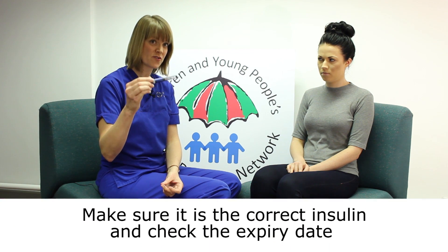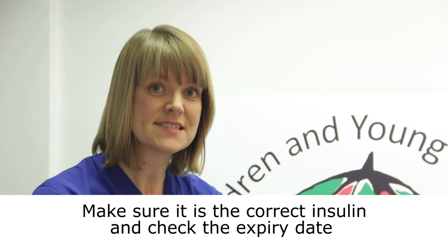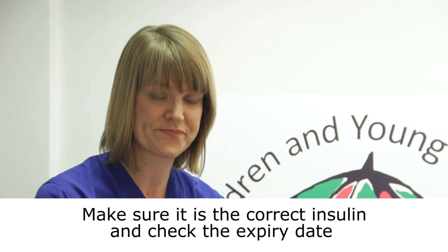It's important that you check that the insulin you're about to give is the correct insulin for the time of day, and that the insulin is in date. The insulin name and date are clearly stated on the cartridge.